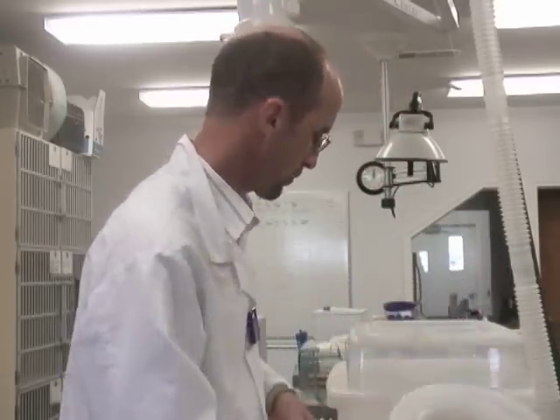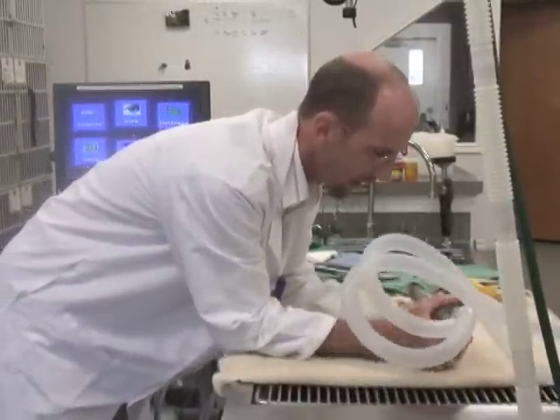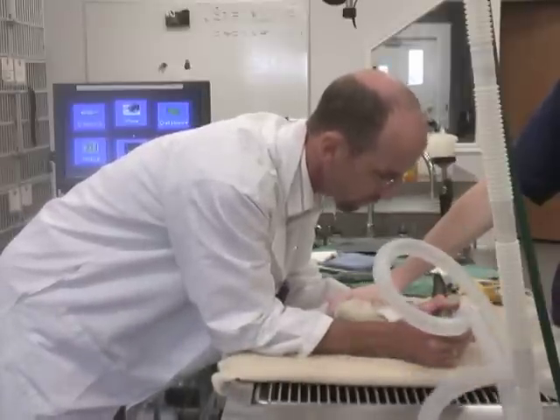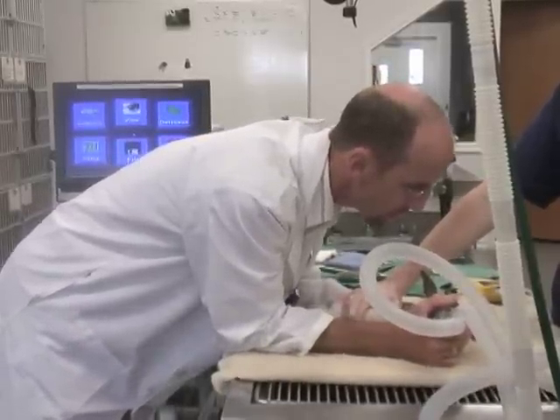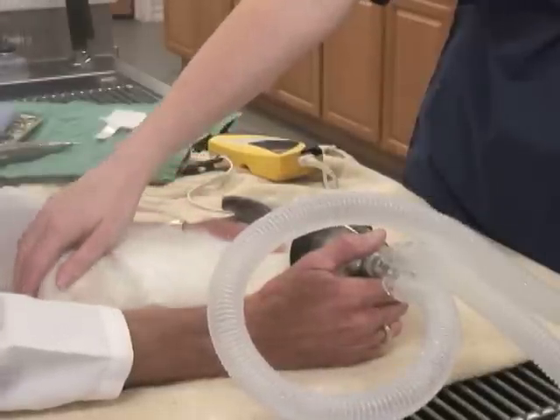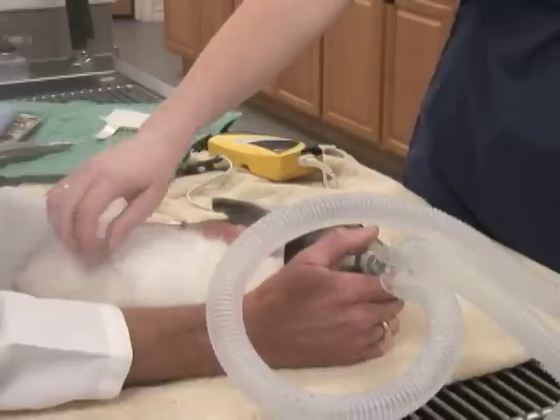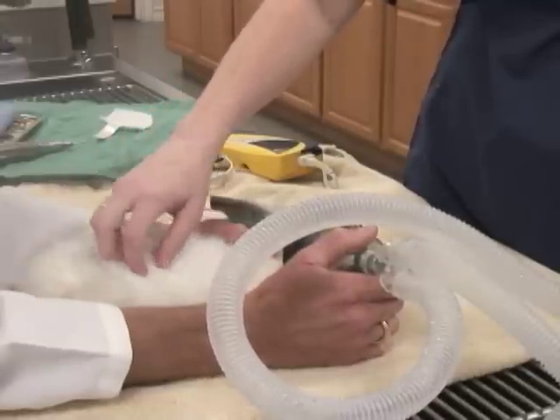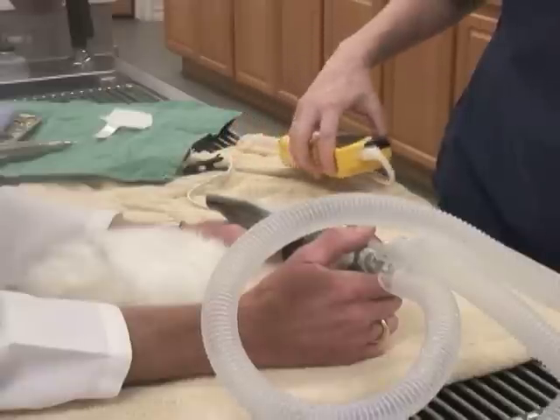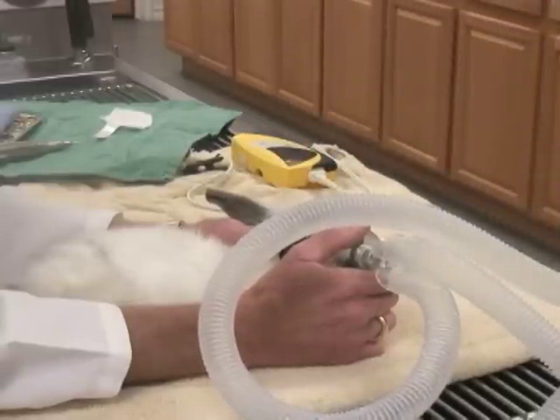We're going to take her out of the box and put the mask on. She doesn't like the smell of that — it's alright, it's okay. Because they will struggle, as we saw her struggle when we first took her out. It's almost impossible when they're fully awake to get them to take the mask. So the box is a nice way where they don't feel threatened and can get a little more groggy from the gas before we put this mask on. Otherwise we'd really have to hold her and she'd fight that mask a lot more than she does when she's almost asleep.